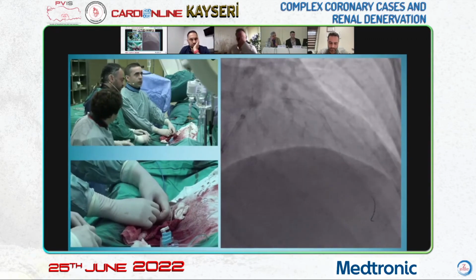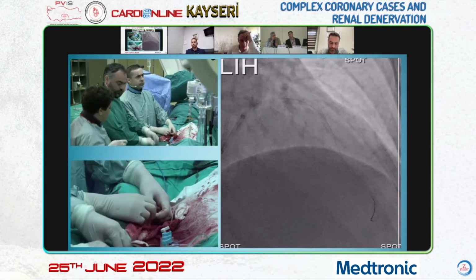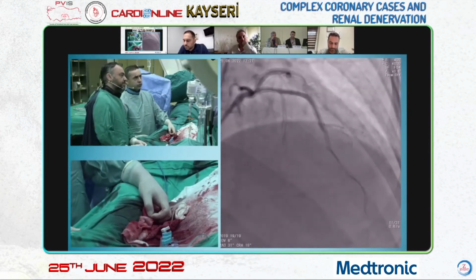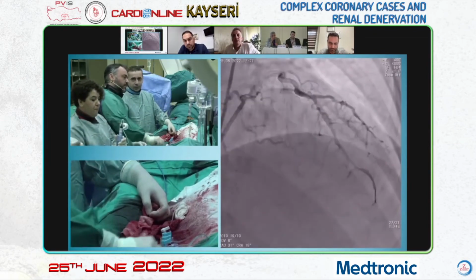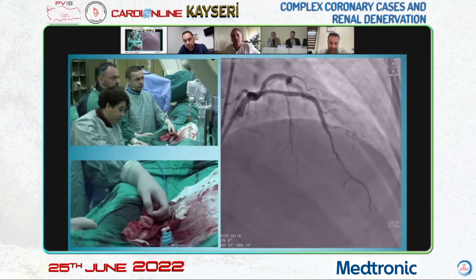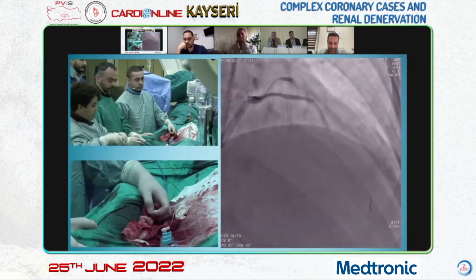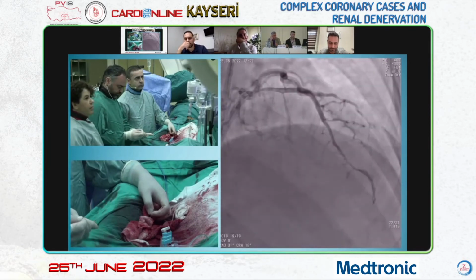Stent visibility is very good. We use the same stent in the other case. While arranging this, with some of the stents the visibility is very low. Of course, there needs to be a clear stent. We give radiation to the patient, so the stents being visible and having a marker is important for placing the balloon in the right manner and gives us opportunities. So when you go above it, there's a dissection, and the proximal segment needs a stent, and I think that this is very useful.